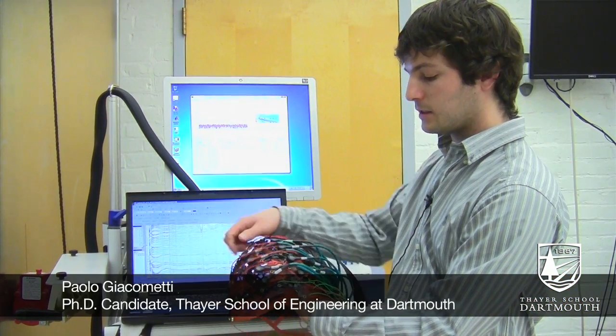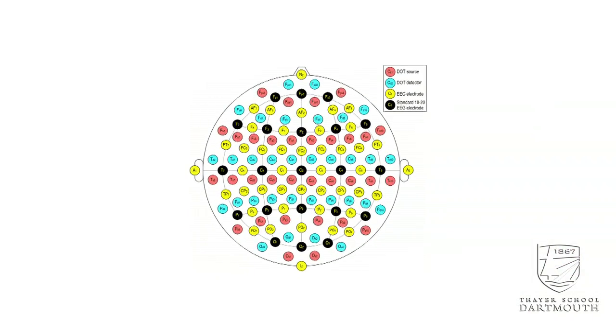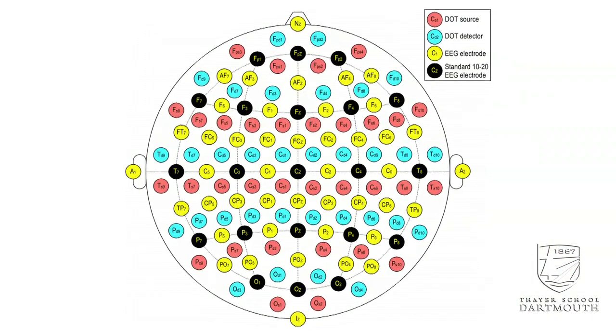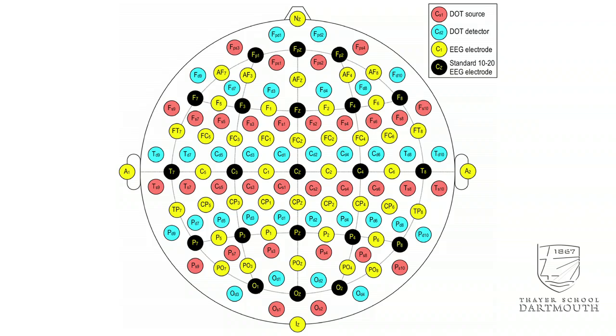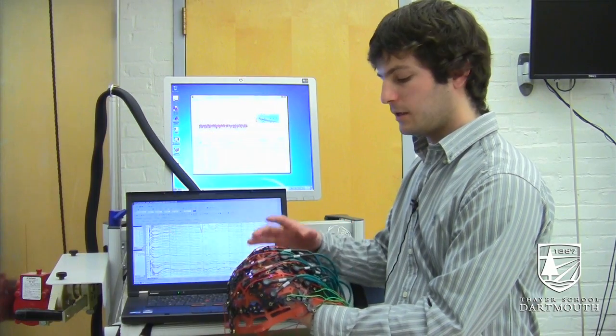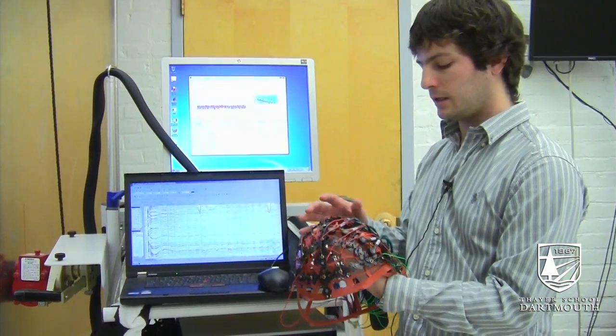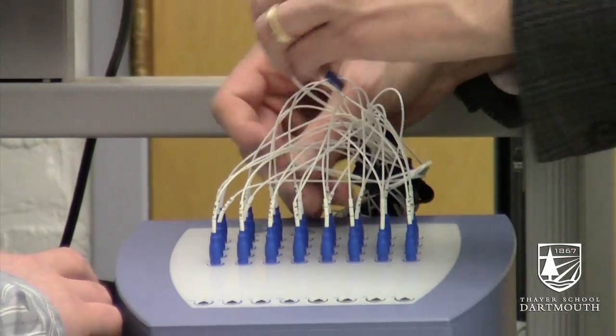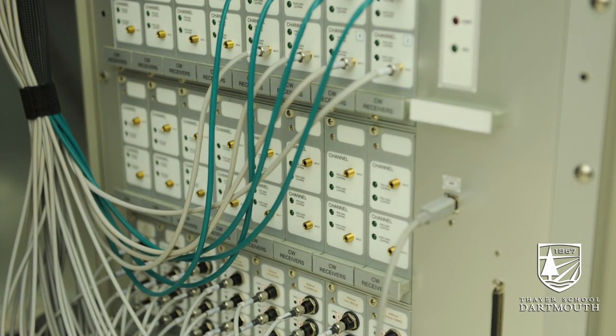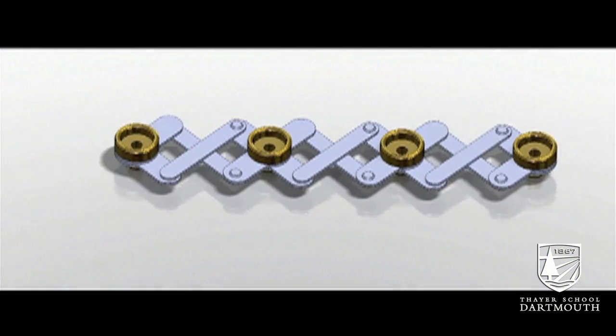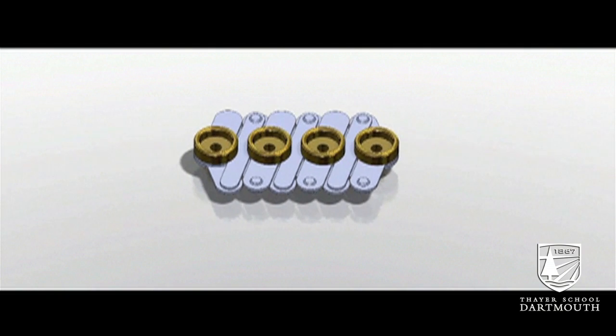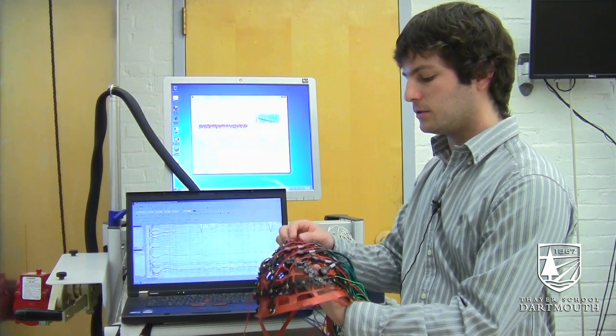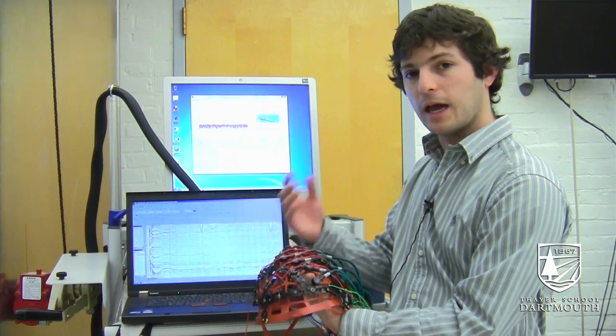What we have here is the Dartmouth probe. It has 65 electrodes that measure electrical activity coming from the brain and it has 64 optode positions that illuminate light into the head and detect it. The head probe is designed to be compatible with a wide variety of EEG systems and near-infrared spectroscopy systems. It is made out of these linkages that expand and contract to fit a wide variety of head sizes and shapes and it's very easy to fabricate, assemble, and use.